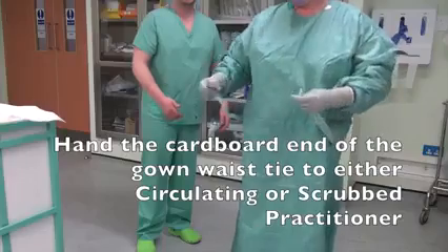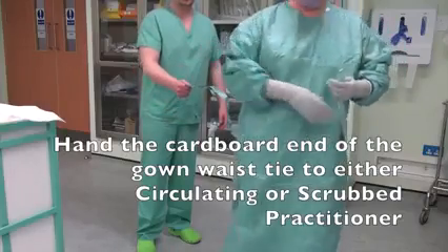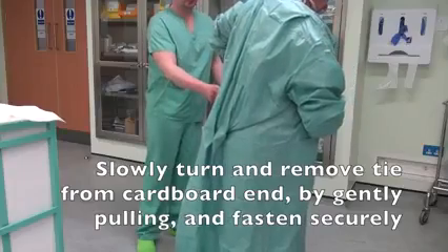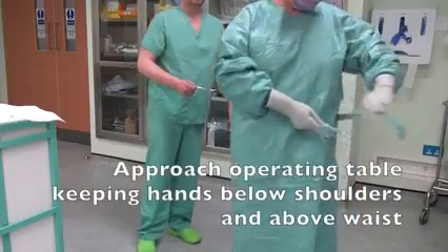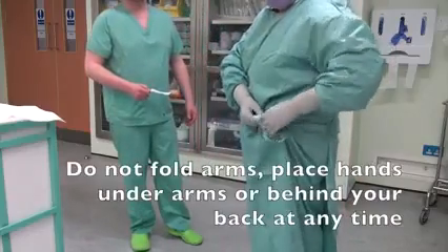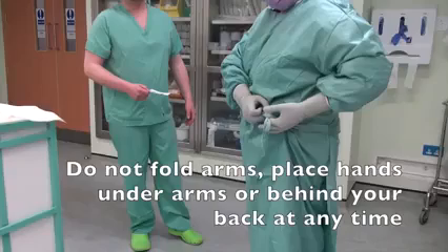Hand the cardboard end of the gown waist tie to either the circulating or scrubbed practitioner. Slowly turn and remove the tie from the cardboard end by gently pulling and fasten securely. Approach the operating table, keeping hands below shoulders and above waist. Do not fold arms, place hands under arms, or behind your back at any time.